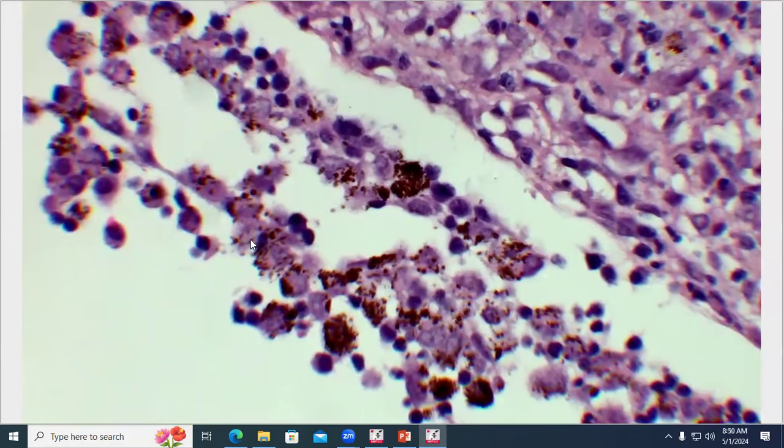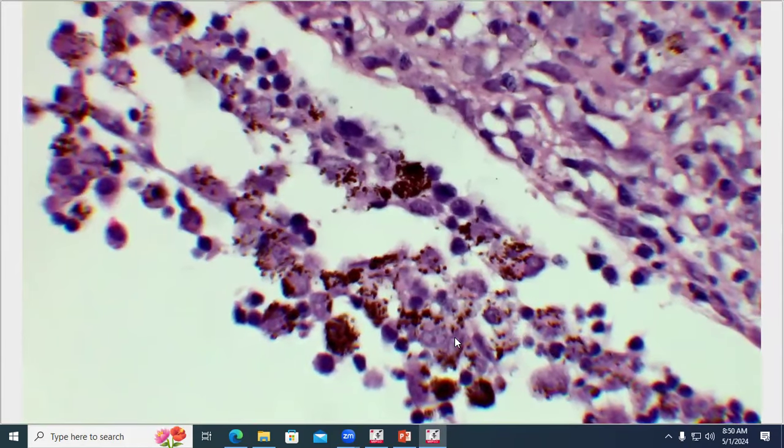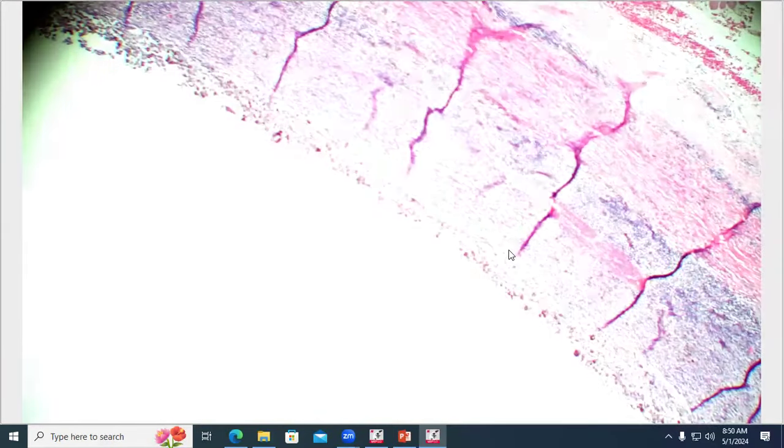Australians too, yeah. So they are elongated, and that is very useful to identify RPE cells, not only histologically, but if you end up with a vitreous cytology or something like that, and there's retinal detachment, RPE cells are floating around, you can identify that by the elongated melanin granules. So they are suffering here too. Regardless of the shape of their granule, they are also in the mix.